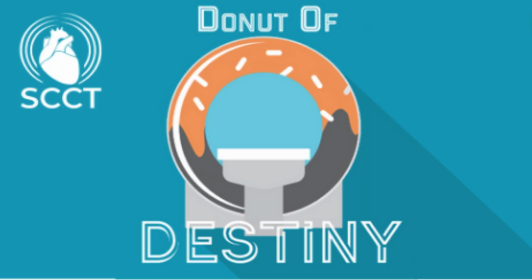Yeah, I mean, I think the future is really potentially very exciting. CTs are very, very widely used. We have them, and to be able to apply a computational tool to a CT to get information about flow velocity and hemodynamics would be extraordinarily promising. Look at the impact of HeartFlow and other programs that use CFD to model flow through coronaries. We could potentially be doing those kinds of things on CTs for valves as well.